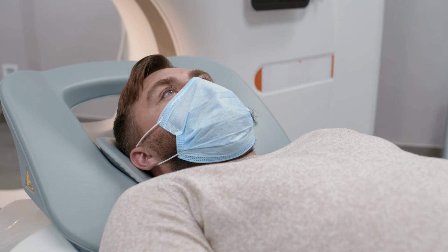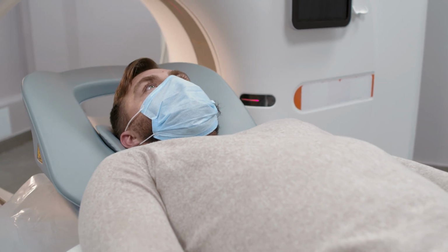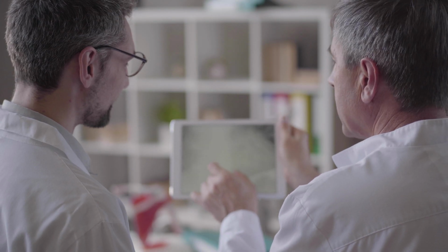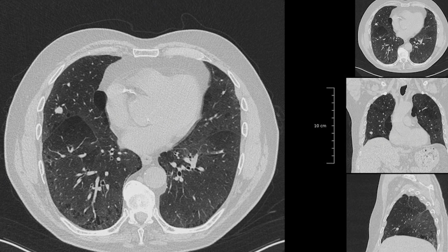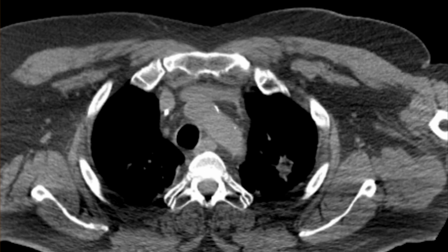But the important thing to understand is that the imaging appearance is not going to go away immediately. Indeed, if you repeat a scan the next day or in a couple of weeks after the procedure, it will likely look a lot bigger than before because we treated the tumor and a little bit of margin around the tumor. But that's why you need to understand the procedure and understand the imaging afterwards. And that's because these areas that are treated, although they may look bigger in a regular CT scan, should not take up any PET contrast. So they should not be hot on the PET scan. And that is how we know that our treatment has worked.